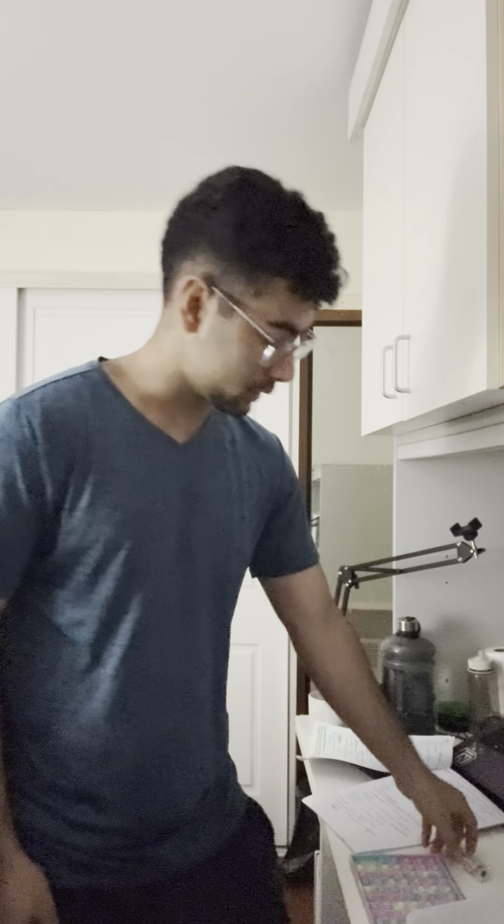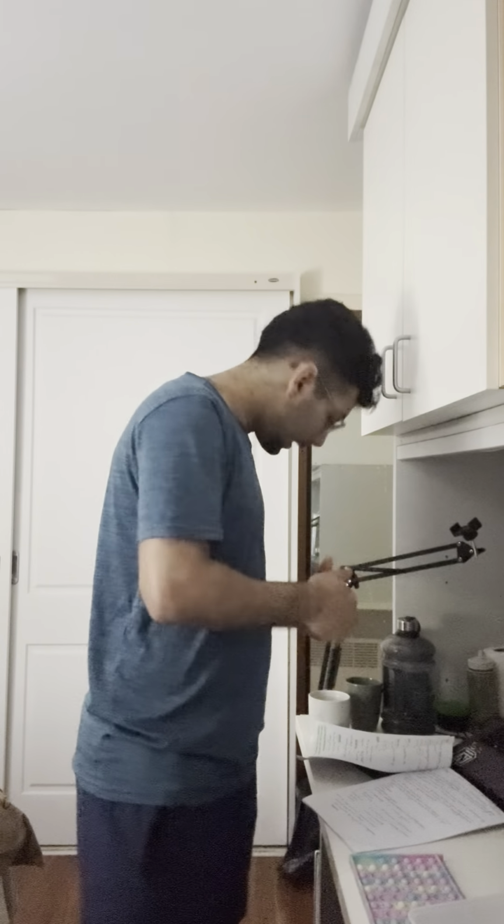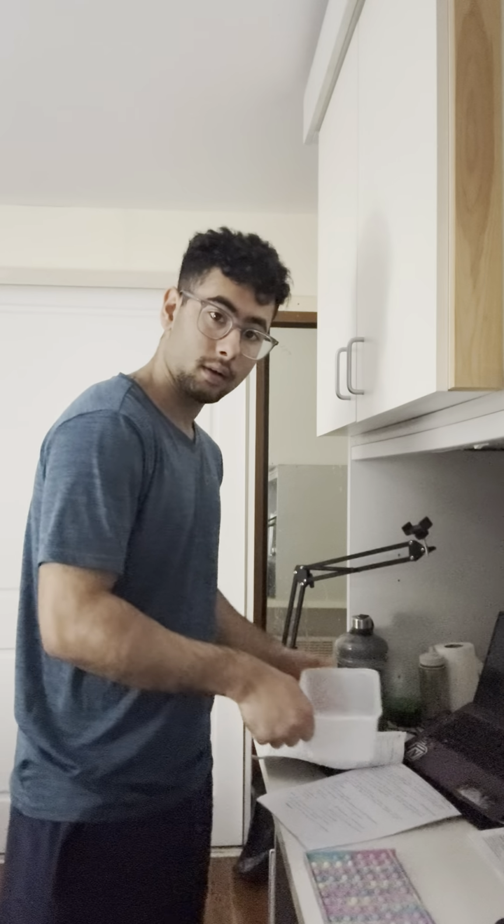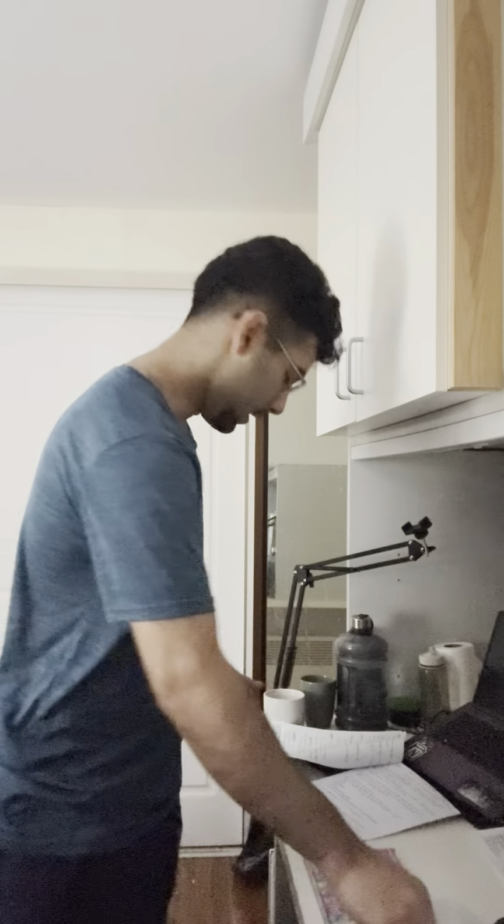Now I'll take my vial as well, and I am not wiping it, as I said already. And I will do my third check at the bedside as well. I go to the patient, she's all right, she went to the washroom. She's flat in the bed, and she's the patient for now. And I have my stuff there. This is a kidney dish, for example. I don't have all the stuff that I need, but I'm just explaining what I have, right?